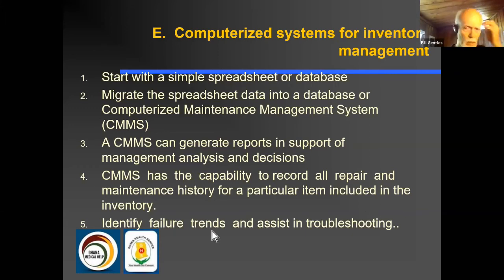Once you've got this kind of information in a database program, then you can start to see trends. You can do reporting to identify trends in failure, assisting in troubleshooting. So if a specific problem has occurred in one part of the country and it's been documented in the database, it will help other people who are encountering the same problem perhaps a month later to realize that somebody else somewhere else has found the same problem and has already come up with a solution. So you can save hours and hours of troubleshooting time if you can share this data in a consistent fashion with each other.